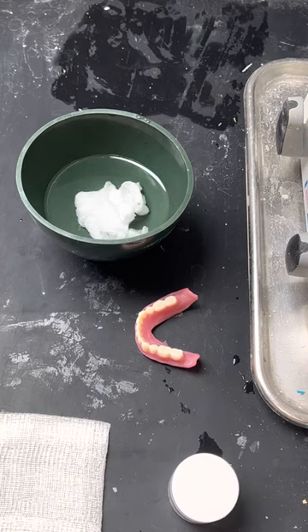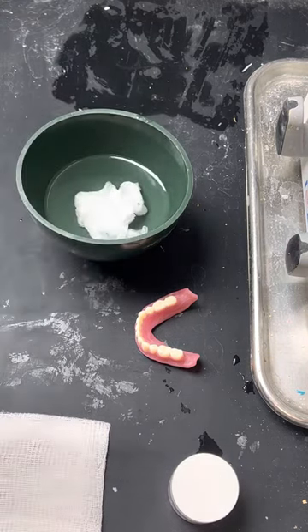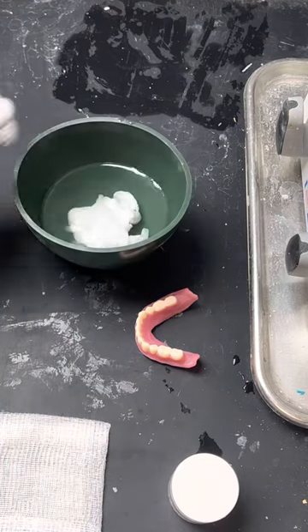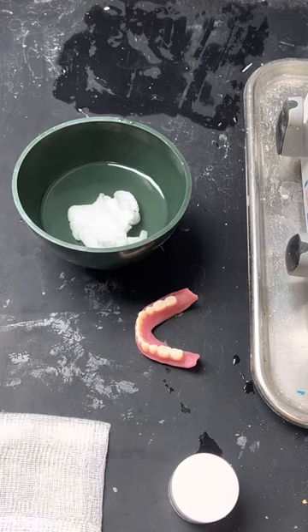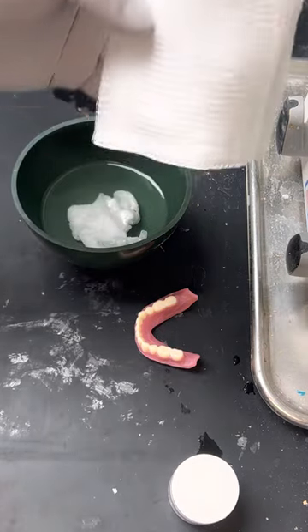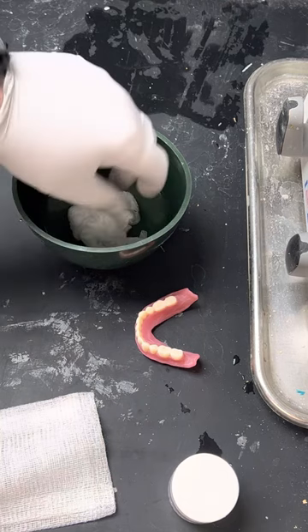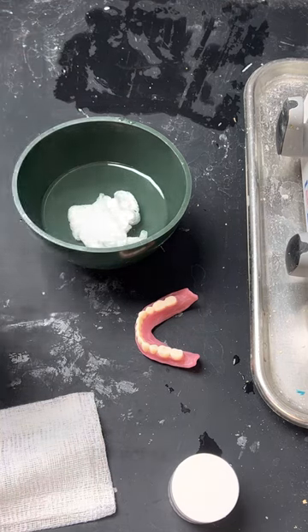So if you just throw compound into hot water — whether it's a water bath, the Whip Mix one, or you just have some hot water in the mixing bowl — it will actually stick to the mixing bowl. I've tried that before; it makes a huge mess. What he does is take some gauze, like a 4x4, wrap the compound in there and throw it in the hot water. It doesn't stick to the gauze and it doesn't stick to the bowl because it's wrapped.